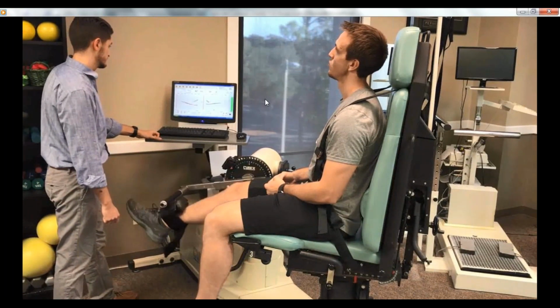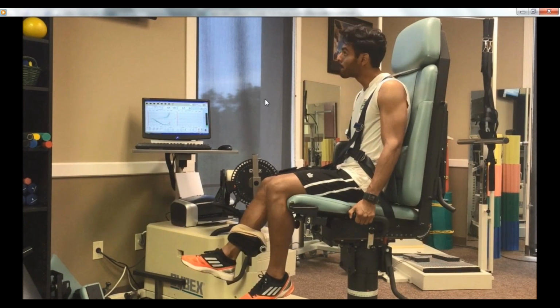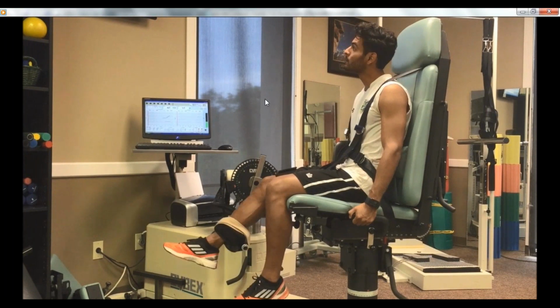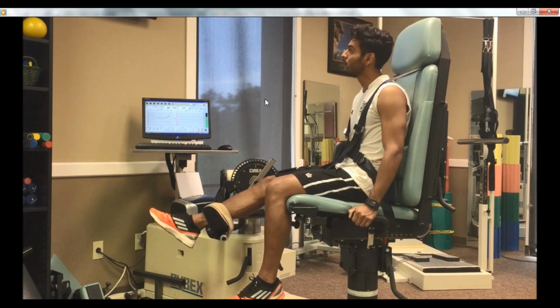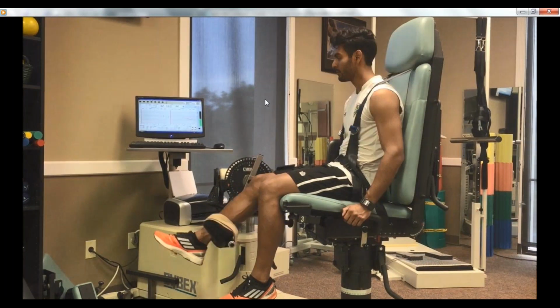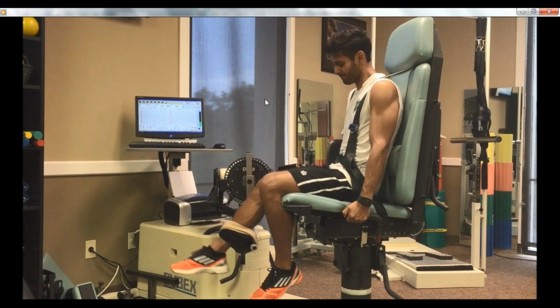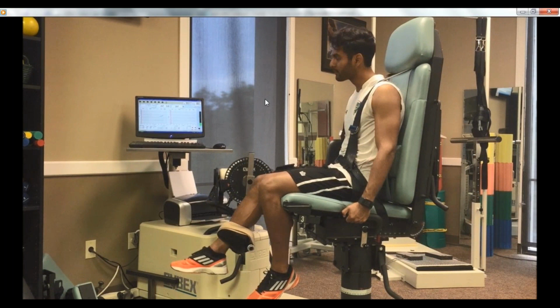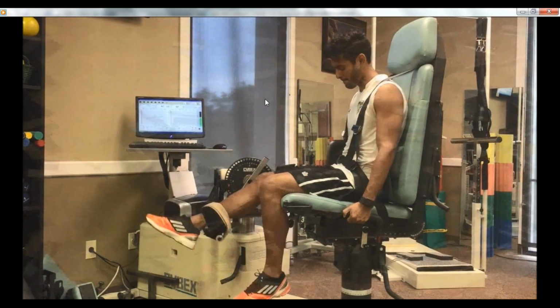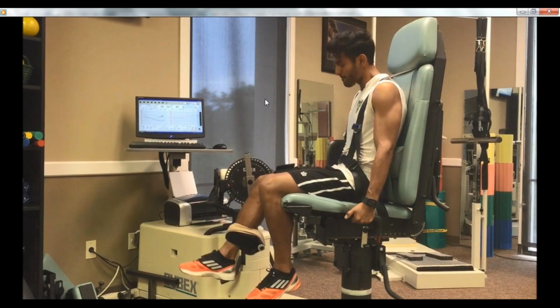All right, so now we're in deceleration training. So he's contracting eccentrically at 40 degrees per second, and the machine is bringing him back up at 20 degrees per second, or half that. So this is set 2. He's 60 degrees per second eccentrically, but 30 degrees per second concentric. And you know it's deceleration training because the contracting speed is twice as fast. This is his 3rd set for the day. 80 degrees per second eccentrically, 40 degrees per second concentrically.